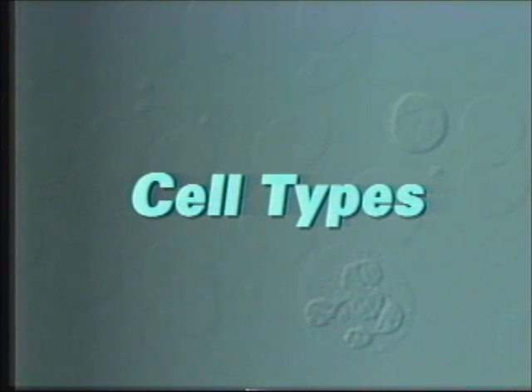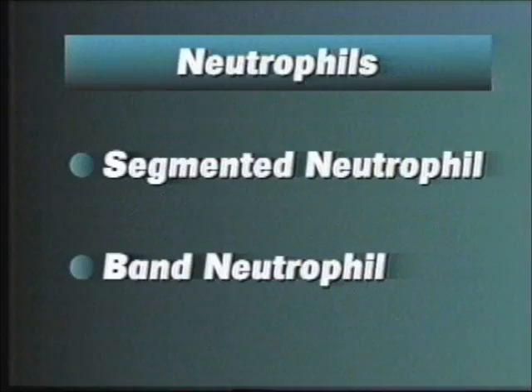We are now going to talk about the various white blood cell types seen on routine differentials. The procedure we included with the documentation lists these cells, the recommended way to report them out, and conditions under which we report and recount. We are going to begin with the neutrophil, and first the segmented neutrophil. After we have given descriptions of both the seg and the band, we will then talk about the differences.